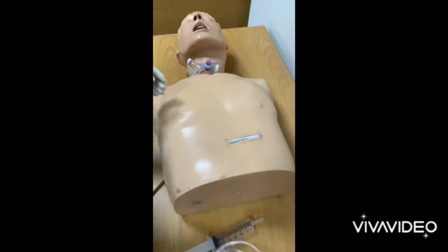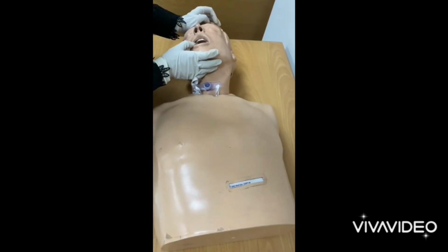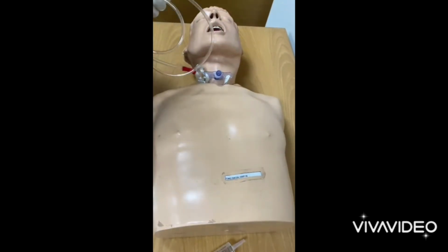Now approach the patient from his right side. Check for the patency of nostrils. Look if there is any obstruction, DNS or any polyp. If the nostril is open, start inserting the NG tube.